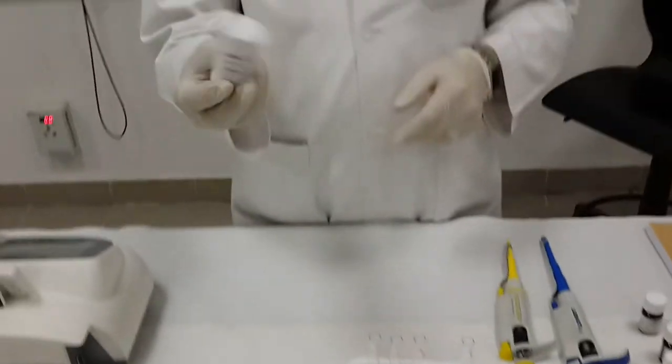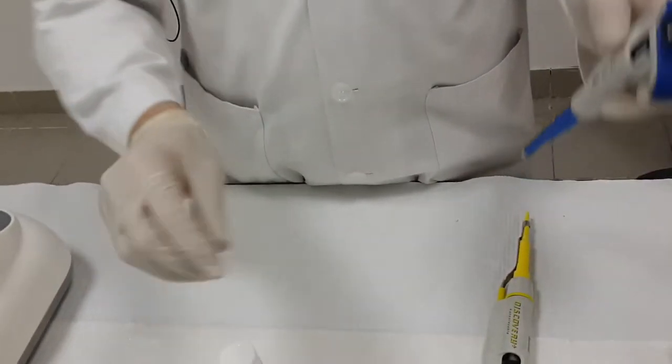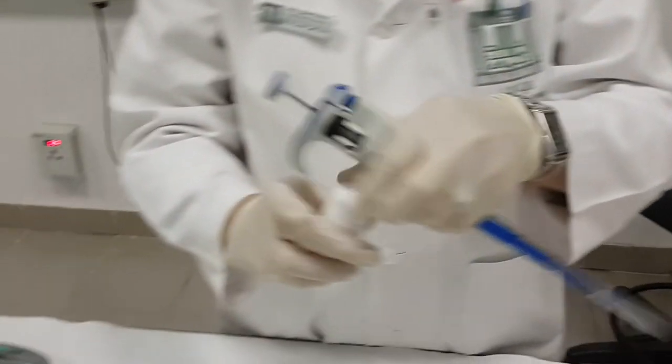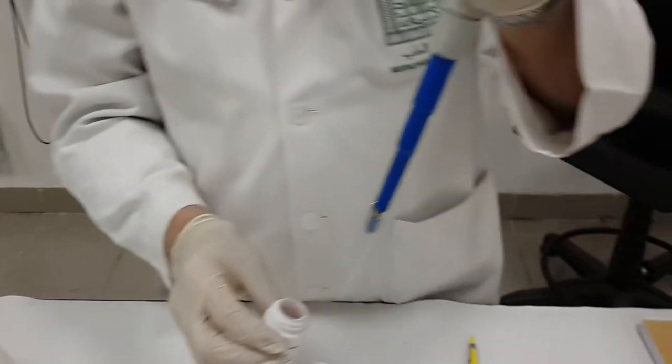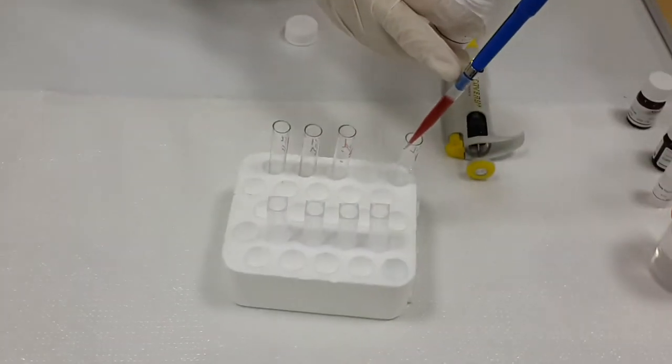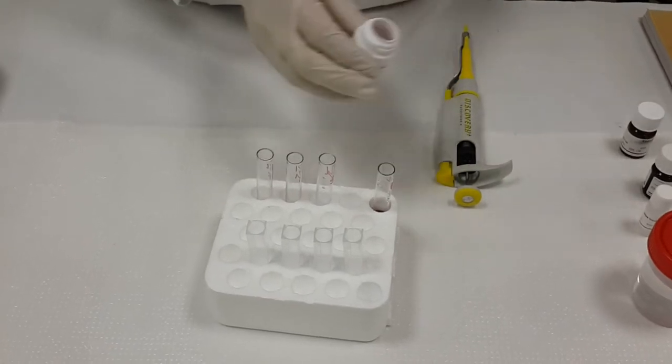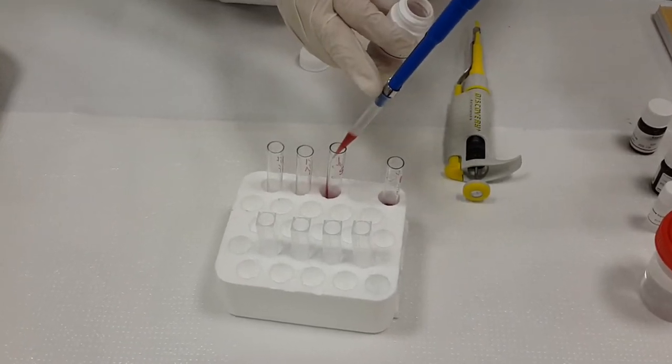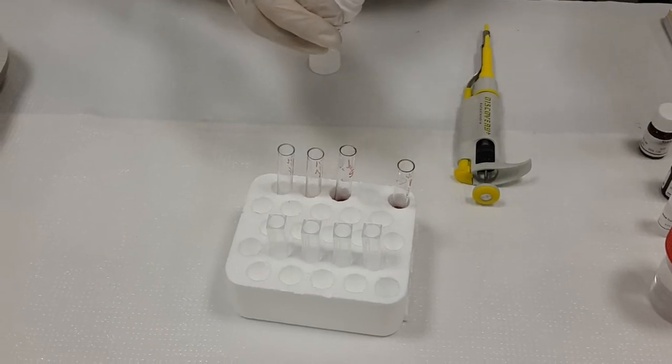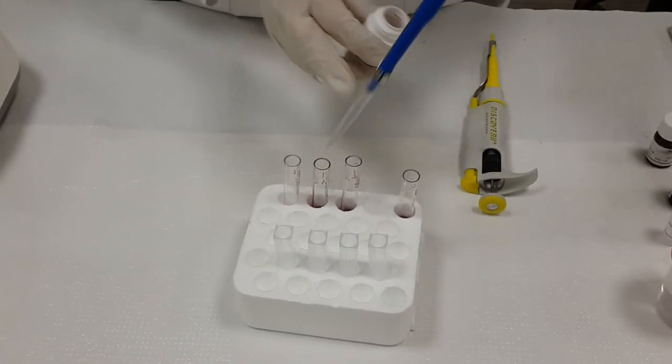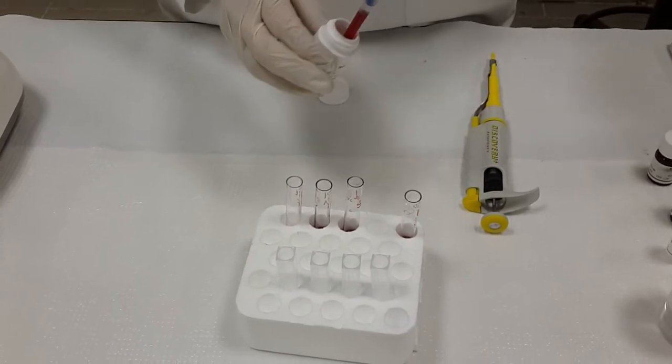Then, as usual, we have to remix the reagent in order if some precipitates are found to be dissolved again, to have a homogeneous solution. Then I will take 1 ml from the reagent and I will put it for all tubes. 1 ml for each tube.